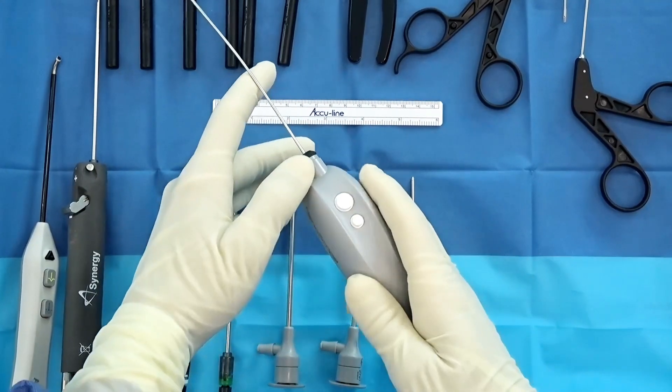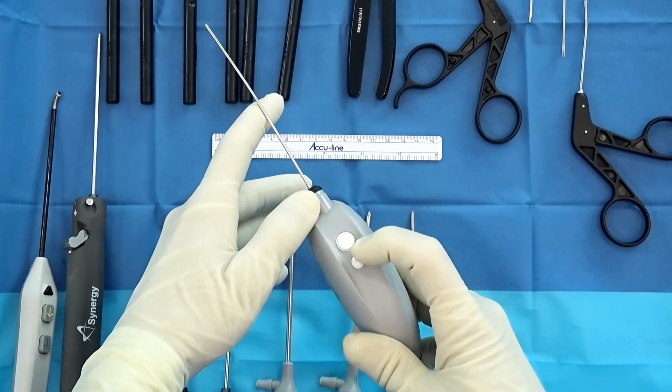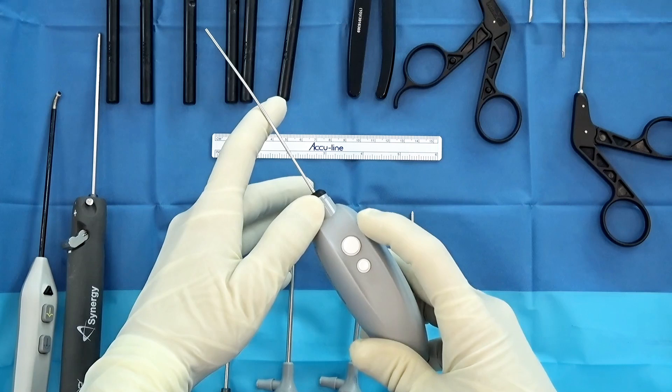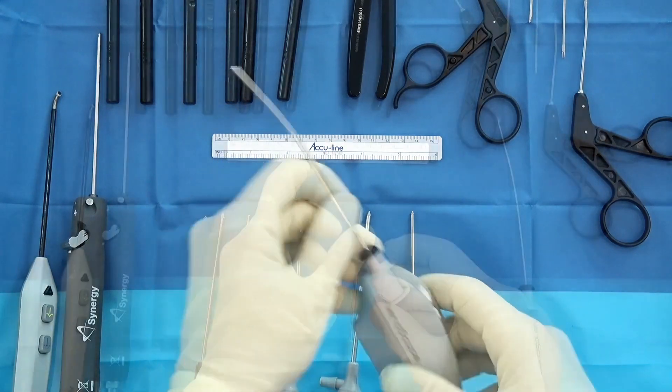Looking at the scope handle, I'd like to point out the buttons. These buttons are highly customizable so they can be adjusted to whatever you want. The way I have mine set up: one quick push is a picture and one long press is a video. Both buttons do the same thing because sometimes in surgery we push the wrong button, so that really makes it very user-friendly.